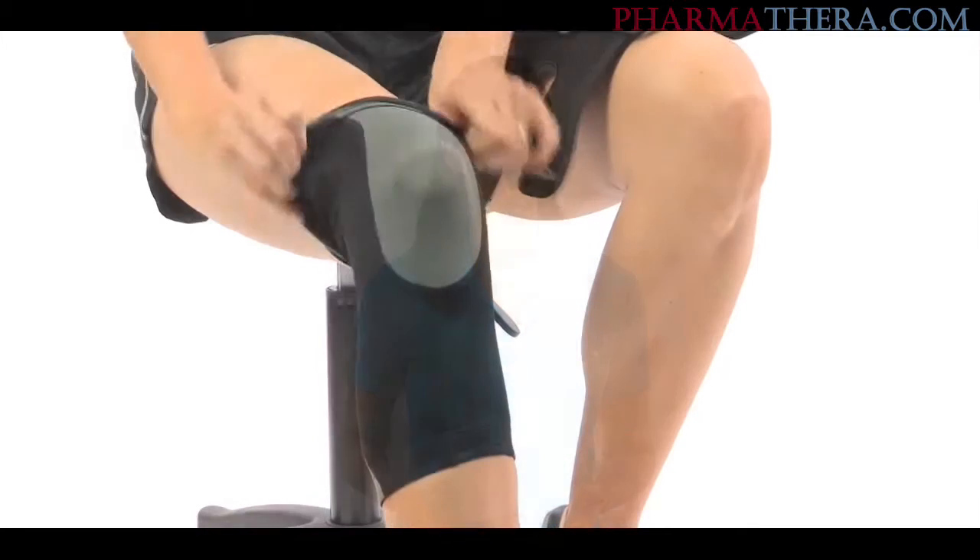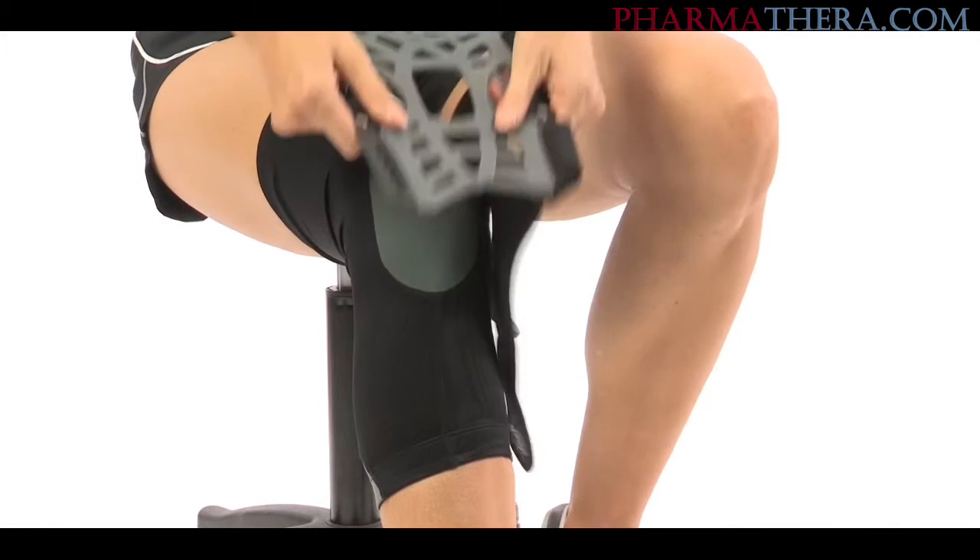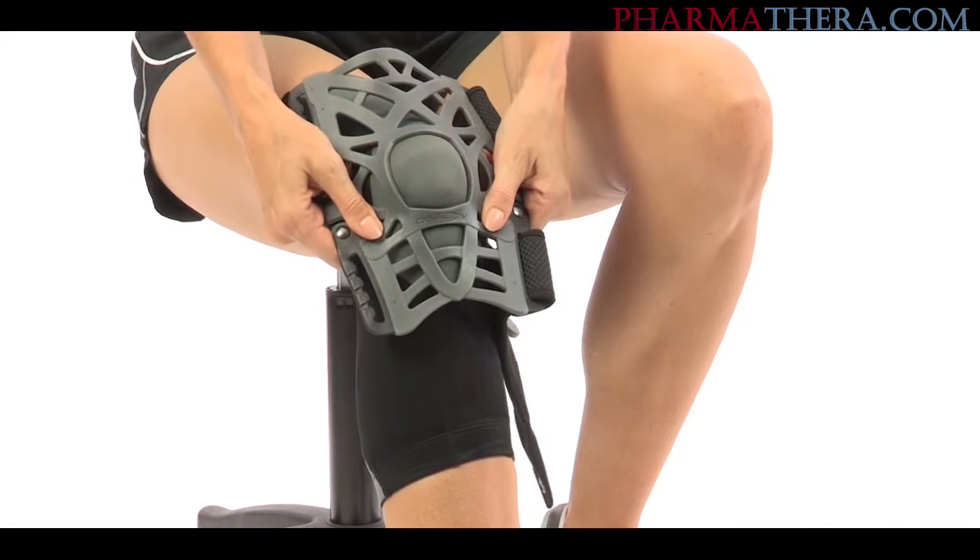The Reaction Knee Brace is easy to use. It comes with an optional sleeve for added comfort. Pull on the sleeve until your knee is centered in the hourglass opening. Next, you'll want to position the web, logo side up, over the top of your knee joint.